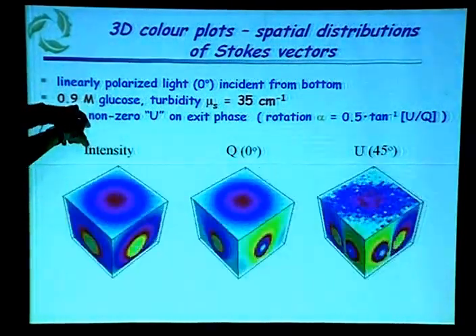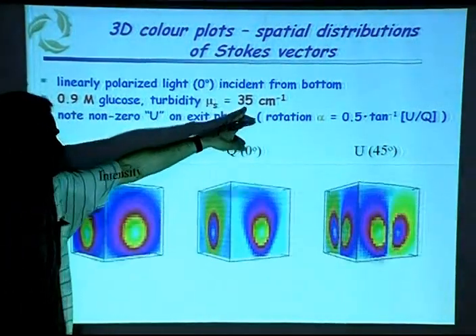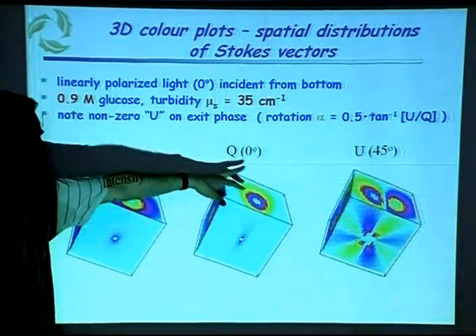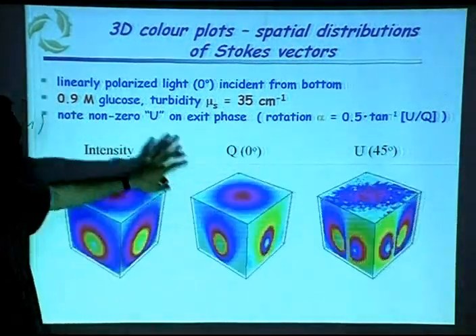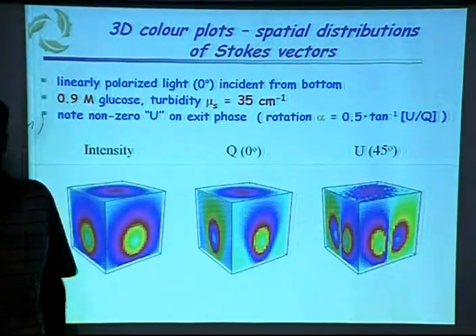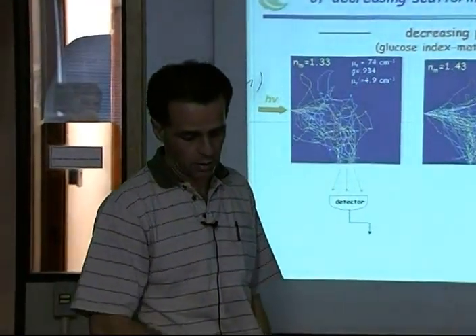And this is fairly heavy glucose concentration, with a fairly low, relatively speaking, scattering coefficient. This is looking at the linearly polarized light component, and then we can compare this with, for example, 0 glucose and try to quantify differences. So this is just giving a graphical representation of what these results can look like.